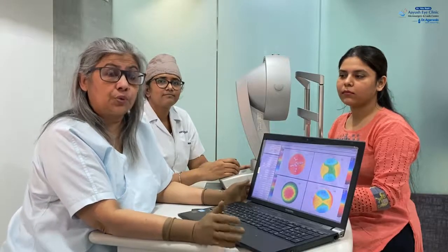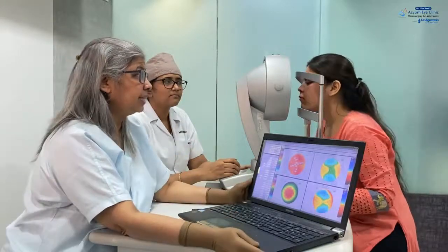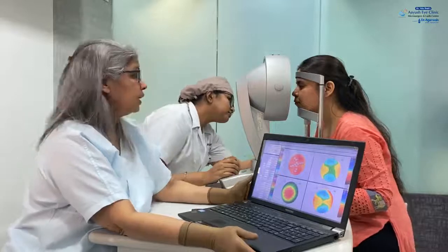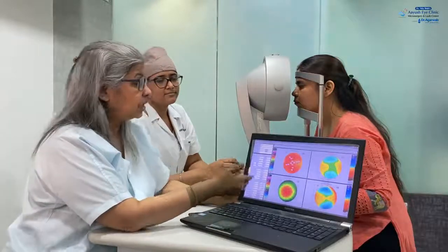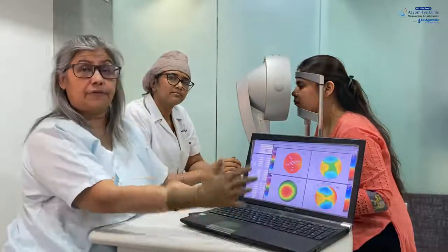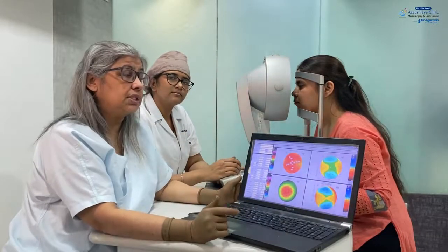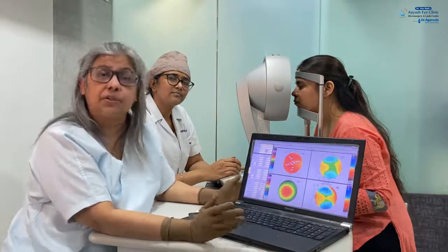So as we talked about Contoura and the general eye checkup which we do for Contoura patients, once that is done and we deem that the patient can proceed with the other special tests needed to decide whether we should do Contoura for this patient, the first test we do is the Pentacam test, where the patient is put on the Pentacam and an examination is done, and what we get is scans like this, which tell us that the corneal thickness where we are going to do the laser is good enough, the curvature is good, and there are no chances or less chances of the patient getting any complication, even if it is 5 or 10 years down the line.